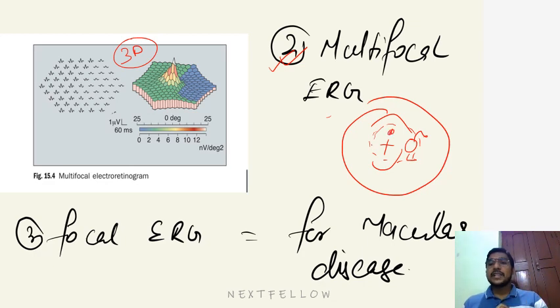So to stimulate this area, you need only a very low intensity, but the amount of photoreceptors, cones and rods, is very low in the periphery. So to illuminate this area, you need very high intensity. Based on this fact, in this 3D picture, the intensity is low, the amplitude is high. Based on this picture, this 3D photo is made, and this is read.